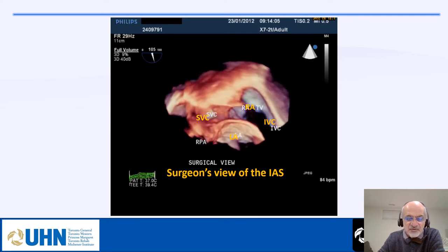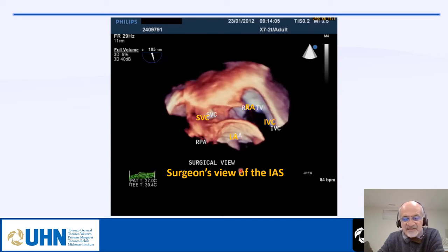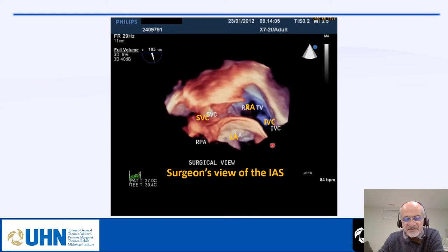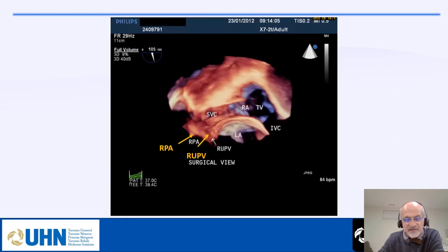The view shown earlier is the echo view, but this is the surgical view. The way a surgeon sees the interatrial septum is with the IVC on the right side, SVC on the left side, the left atrium below, and the right atrium above. You can rotate the picture to see it in this surgical orientation.